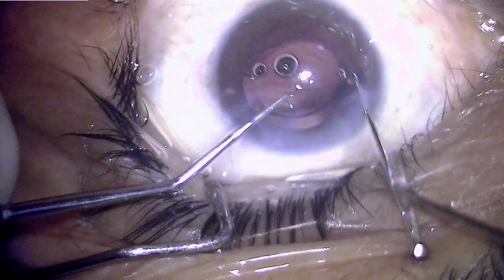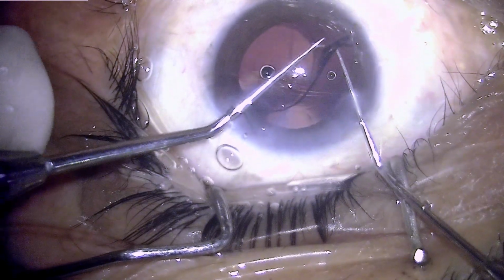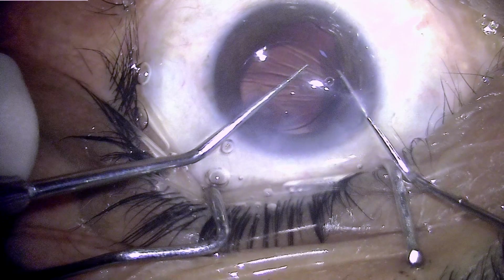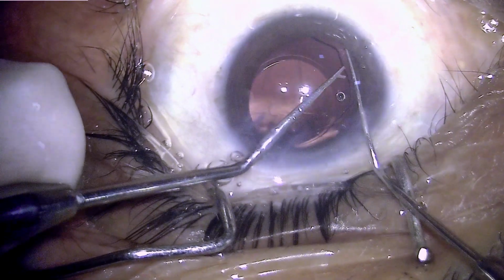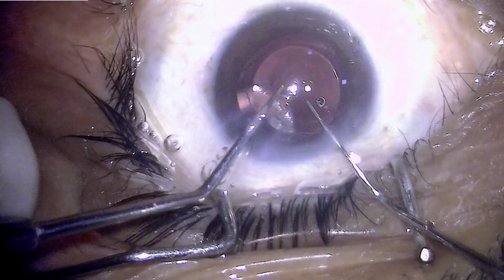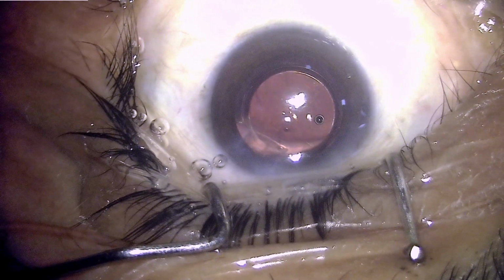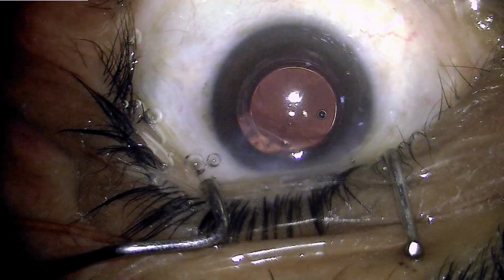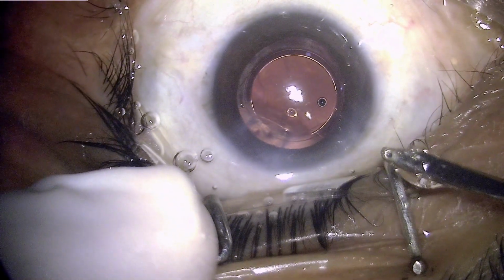This portion reveals how badly the IOL is twisted, and this is all because of improper loading, where the haptic was not folded, rather it was extended in the cartridge, and when it came out it was in this orientation. Because the vitreous is not yet disturbed, we can still see the IOL is well centered. It is not being pushed to any side by the vitreous strands, and we can now proceed on to remove the viscoelastic gel.